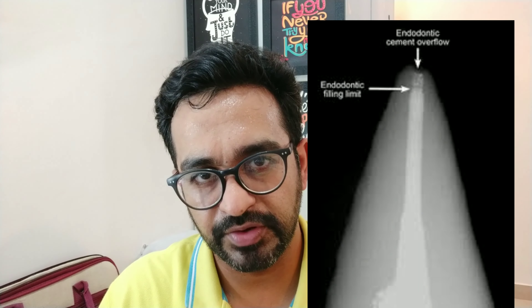After you have done your BMP — biomechanical preparation — when your canal is dry and you have properly placed the 4% 25 paper points or 6% 20 paper points, corresponding to how much canal you have prepared with your rotary files, you must dry the canal and ensure there is no debris and BMP is properly done.